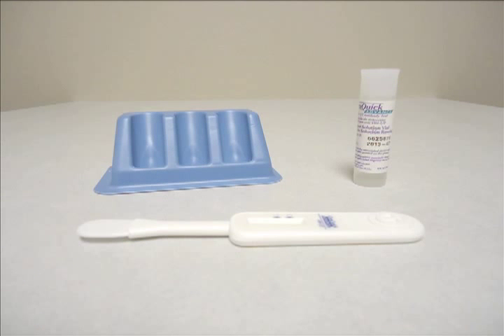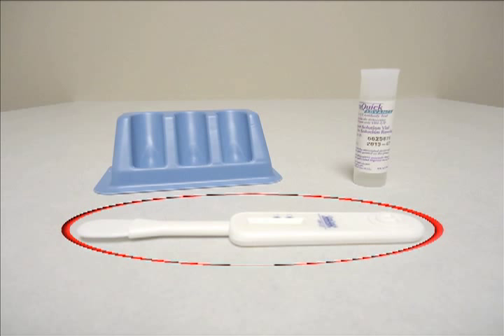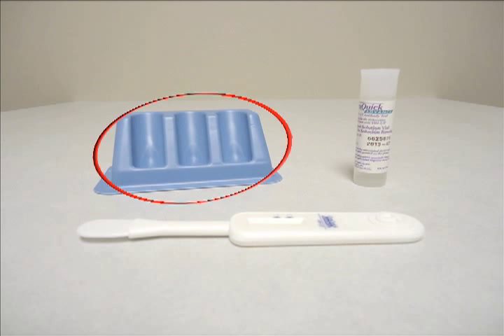The first test we will be performing is the oral fluid procedure. The materials needed for this test, which are included in the OraQuick packet, include the developer solution bottle and the test device. Additionally, you will need the reusable test stand.